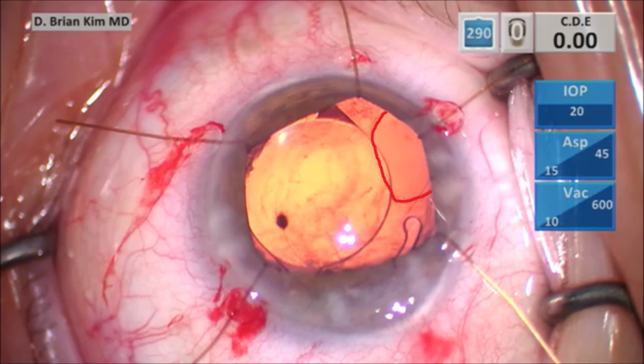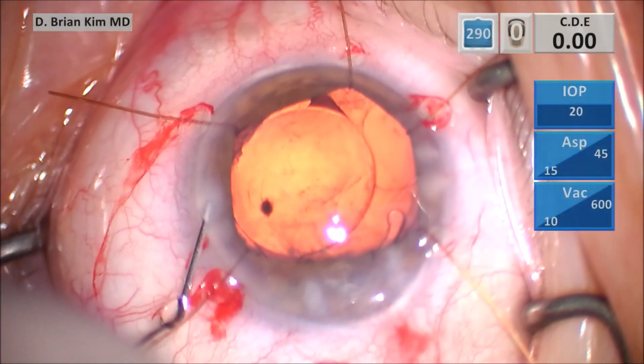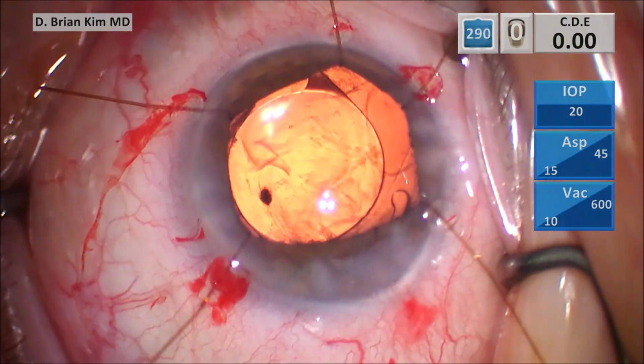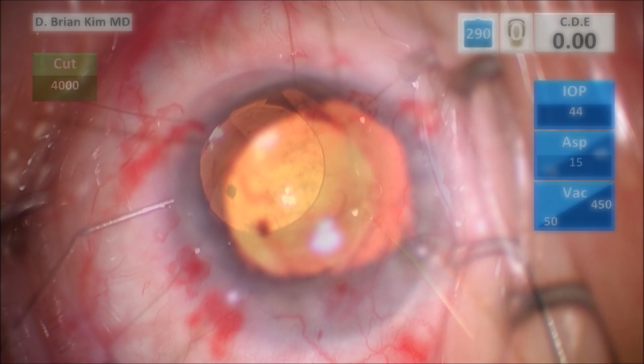And so what am I going to do now? It's okay. The only reason it's shifted like that is because of the posterior capsule defect and because I have no other place for all that fluid to go. So I go ahead and hydrate the incisions, make the eye nice and firm.